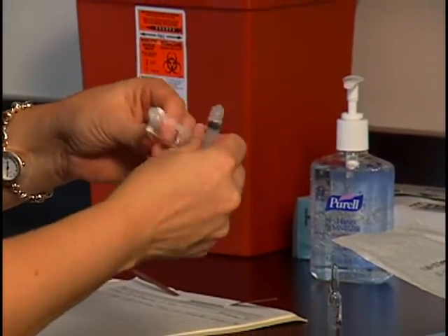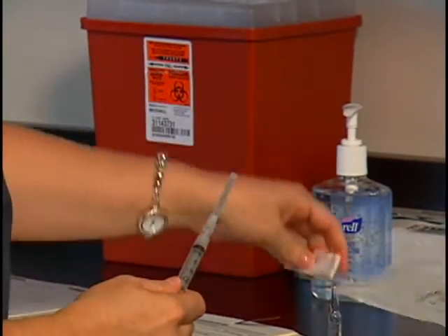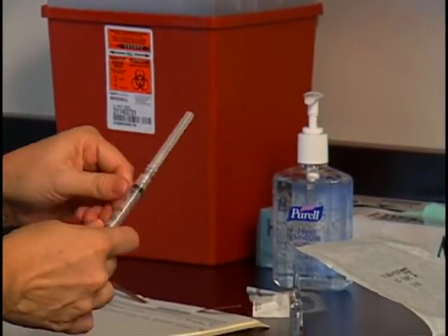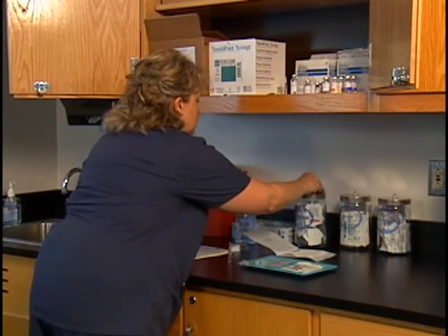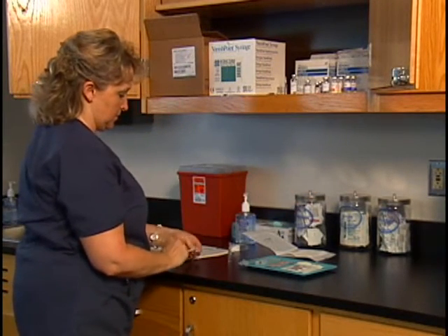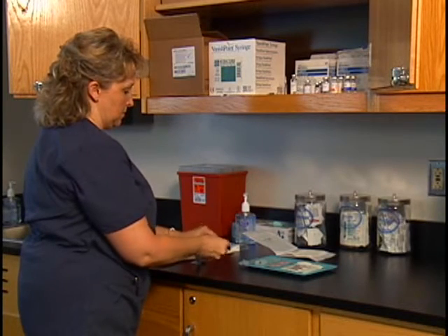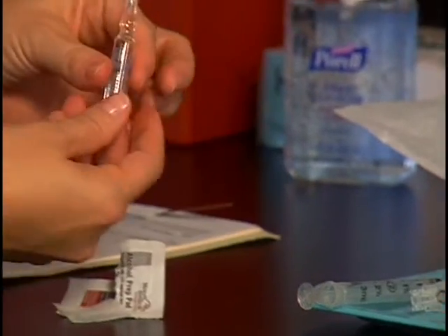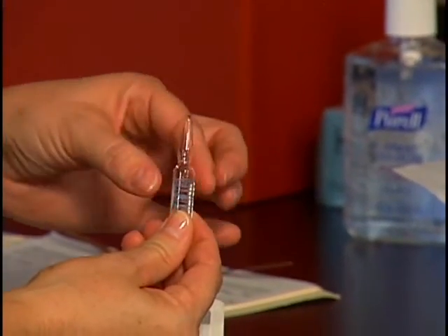Next, attach a filter needle. Open an antiseptic wipe and cleanse the neck of the ampule to remove any dust and bacteria. Tap the stem of the ampule lightly to remove any medication in the neck of the ampule.